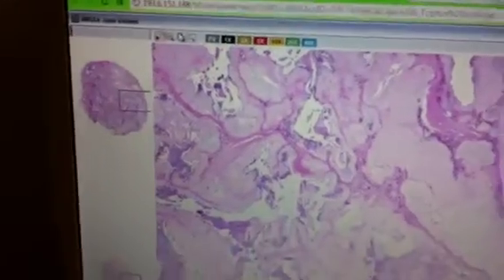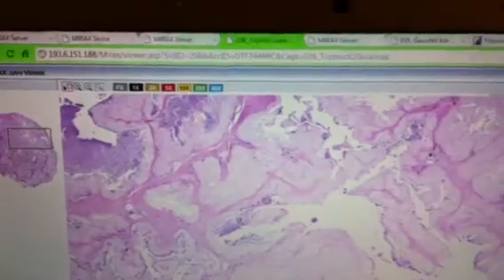So I'm expecting to see some crystals or whatever here. Looks like, so yeah, if you see, the crystals are acting like foreign bodies. So the uric acid crystals themselves are dissolved in the paraffin embedding or during fixation.